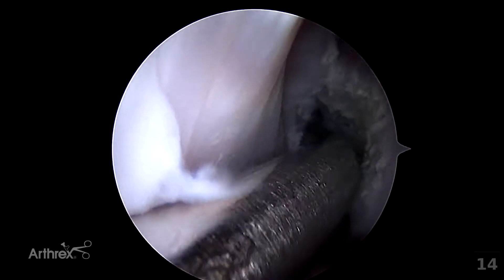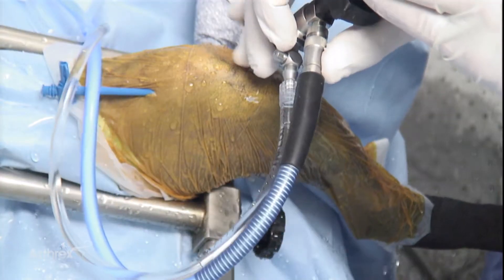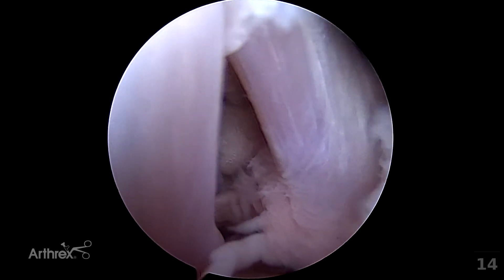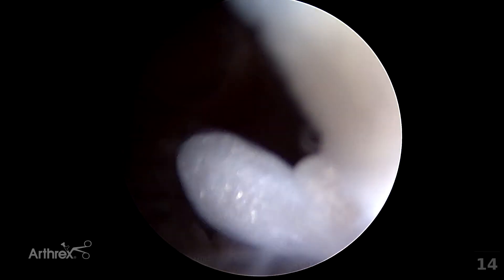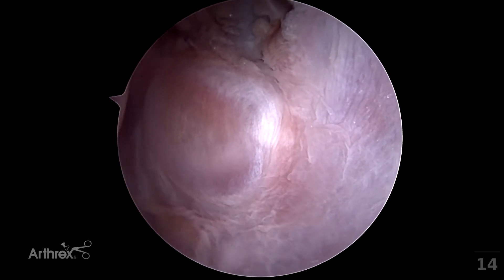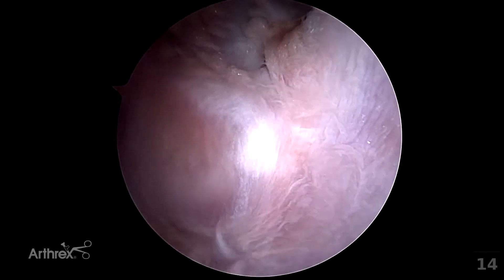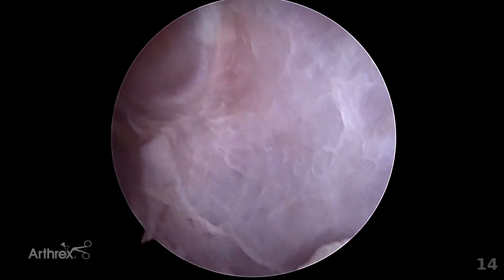As part of this process, access to the caudal joint compartment has been established. If visualization of the caudal compartment is desired, placement of the scope through the notch into this area is possible. The ligament of the lateral meniscus is apparent in the center of the field. By moving between the caudal cruciate and this ligament, it is possible to drive into the joint compartment. The subsurface of the medial fabella is apparent, and this area articulates with the caudal aspect of the femoral condyle. Palpation of this area superficially will allow mobilization of the fabella to confirm the structure.